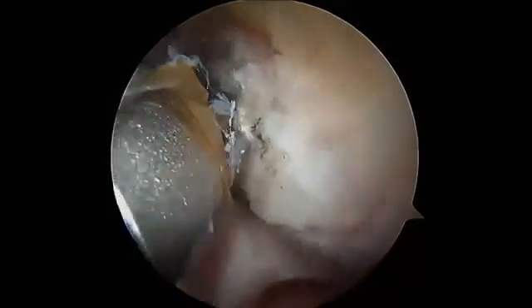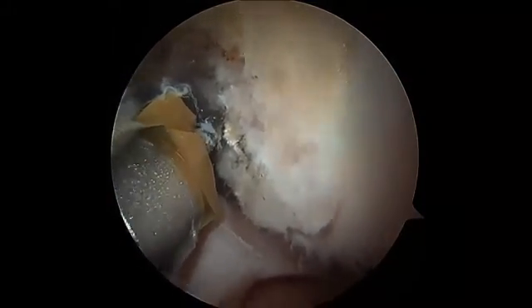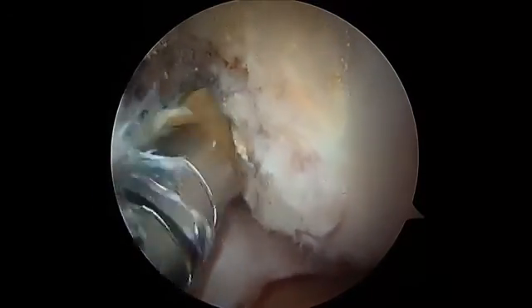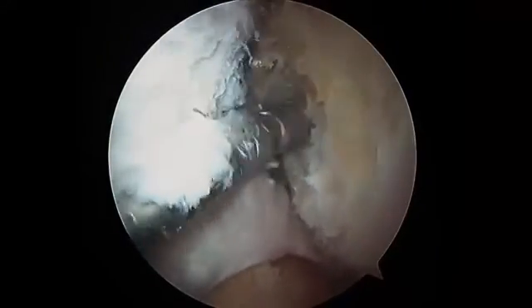So we've got an 8.5 millimeter diameter graft. So we're going to use an 8.5 millimeter flexible reamer, and I'm going to ream to a depth of 25. And we're at 25 now. So we're going to finish our tunnel with a 4.5 millimeter flexible reamer.